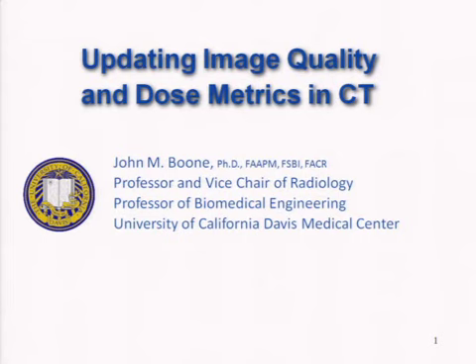Well, that's an excellent question. It's much harder to answer. I think that we are to a point where we can actually assess the dose to the patient within some greater degree of accuracy. Probably, we're sort of talking about 20%, but the reality is, if you do everything right, it's closer to 10%. And so what then do you do with those numbers?